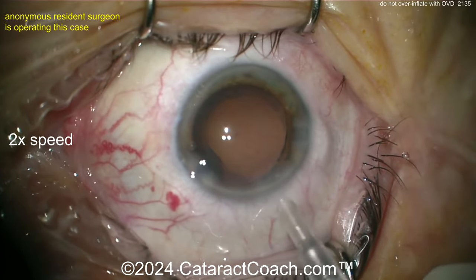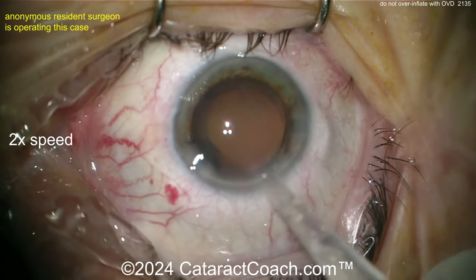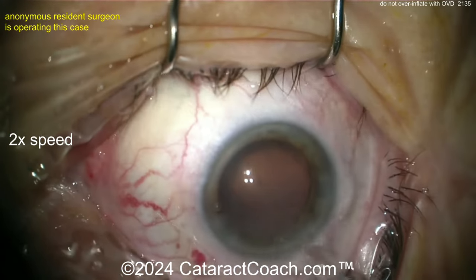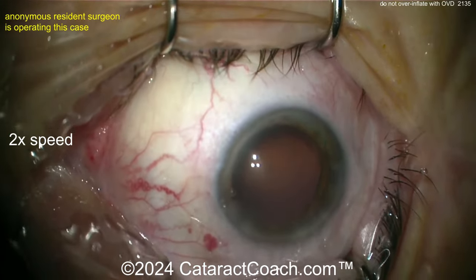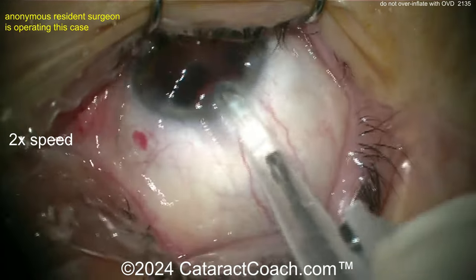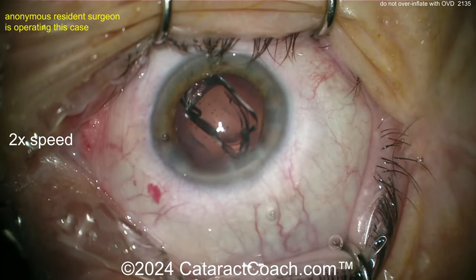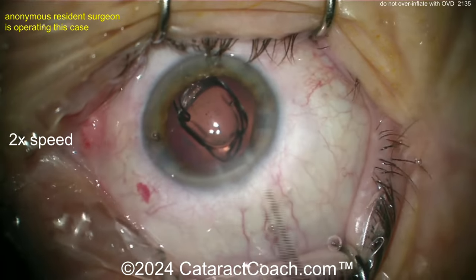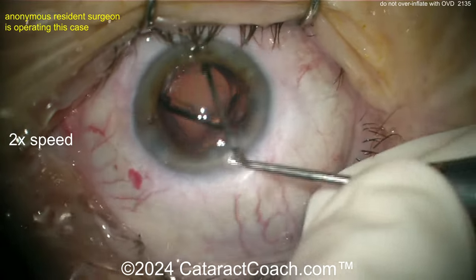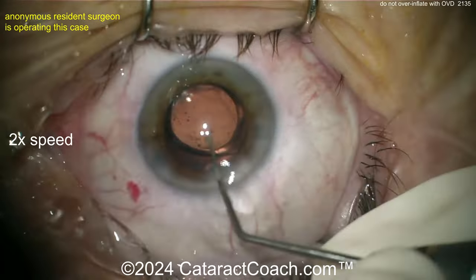Let's see what happens here — here comes the lens. The radialization is sub-incisional, so it's underneath that incision; you've got to be very cautious. In a situation like this, I wouldn't mind enlarging the incision if you need to — just don't put too much pressure. The IOL's in the eye. There it is opening up. Now just get it rotated about 90 degrees — I don't want those haptics in that same area where it's radialized. There we go, I like that. Very good.